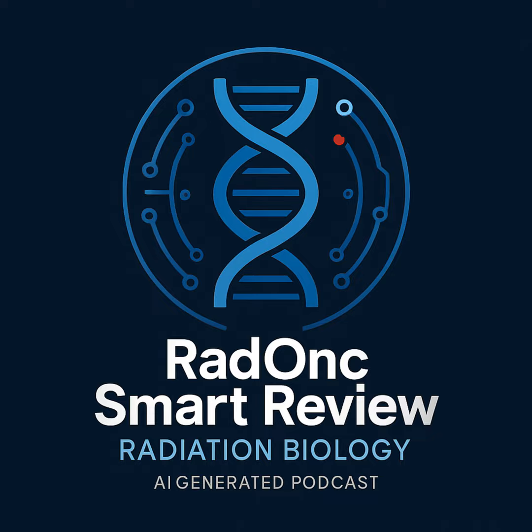What kind of energy? It releases annihilation radiation, specifically 2 gamma-ray photons, each with exactly 511 kilo electron volts of energy. That 511 keV corresponds to the rest mass energy of an electron or a positron. 2 511 keV photons. Okay, and what's the really critical part for making an image out of this? The absolute key is that these 2 511 keV photons fly off in almost perfectly opposite directions, 180 degrees apart. 180 degrees. That seems super specific. Why is that the key?